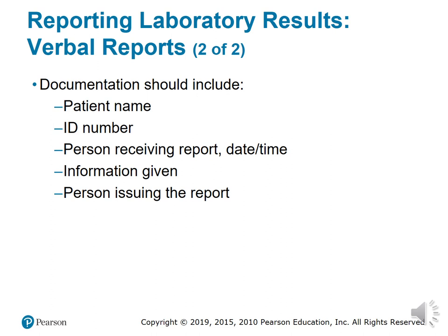When we're doing a verbal report, we have to make sure we obtain all information needed in order to pull up these reports, because we don't want to mistakenly pull up the wrong patient's report. Especially in South Louisiana, we have so many people with the same exact name, especially our older generation, because back in the day, you had your name and then your saint name and then your last name. There are so many Thibodeaux, Boudreaux, Hebert, Broussards, Robichauds that you might have John James Robichaud and then another John James Robichaud. It's just that they might have different birthdays.